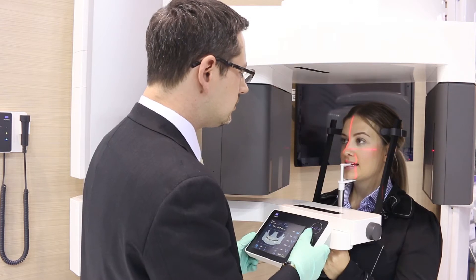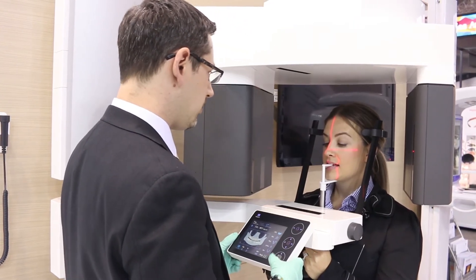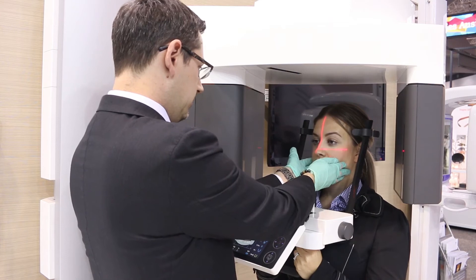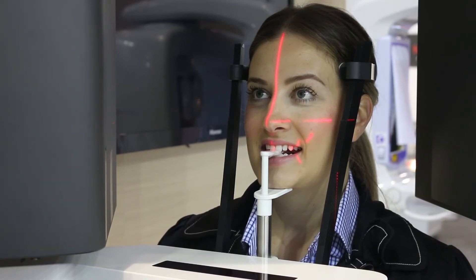Adjust the patient's head position so the centre of their face is in line with the mid-sagittal laser beam. Using the control panel, adjust the height of the horizontal Frankfurt plane laser beam so the posterior section of the beam is aligned with the top of the patient's tragus.